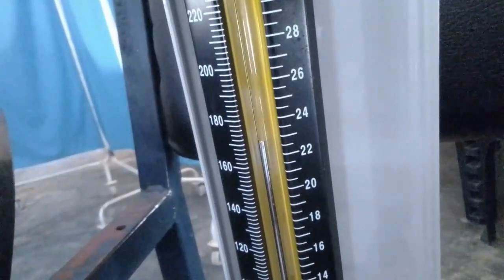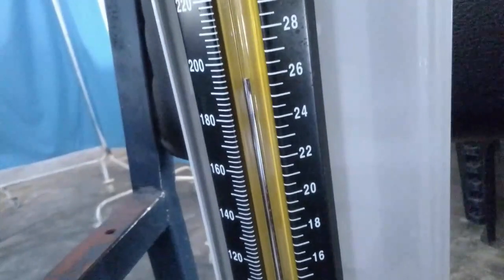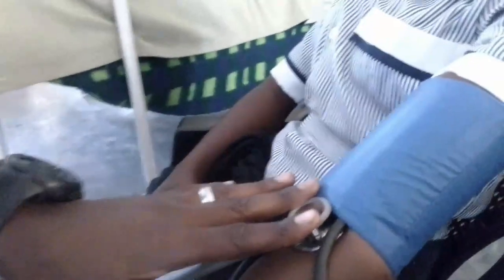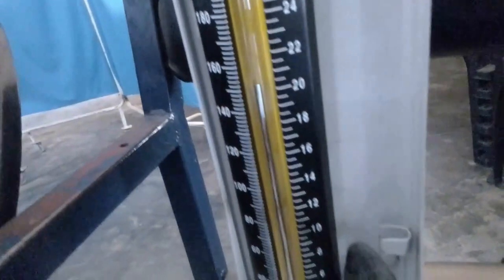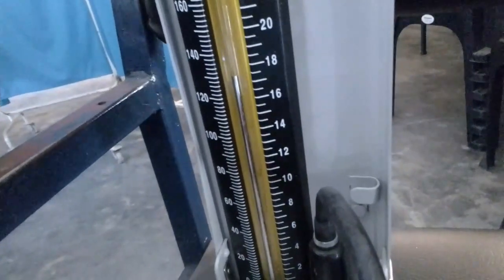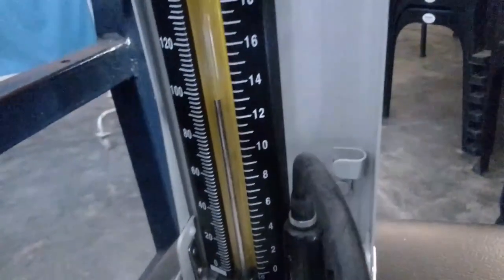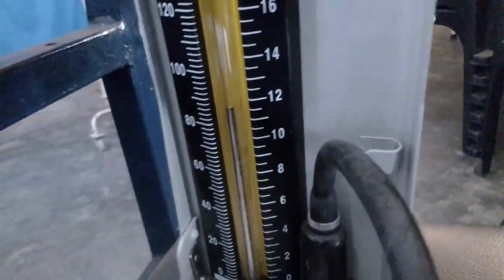So it has stopped pulsating already, so I can at least pump some more, about 10 millimeters of mercury. So then from there, I can put the stethoscope. Okay, then I can start opening slowly. I can be opening slowly, so the mercury is dropping. So as you can see, the mercury is also bouncing.